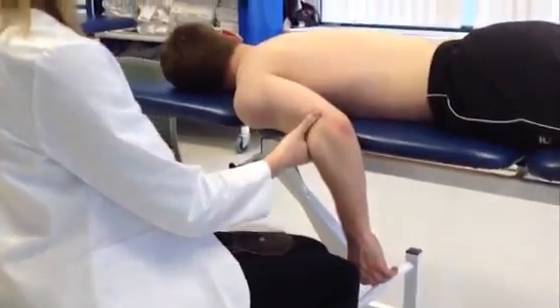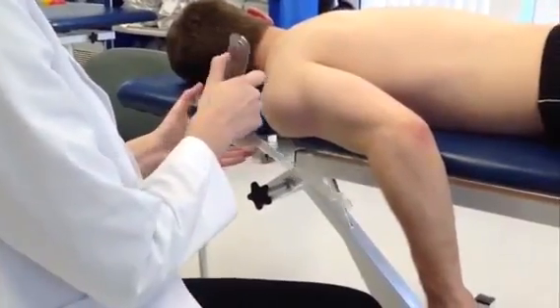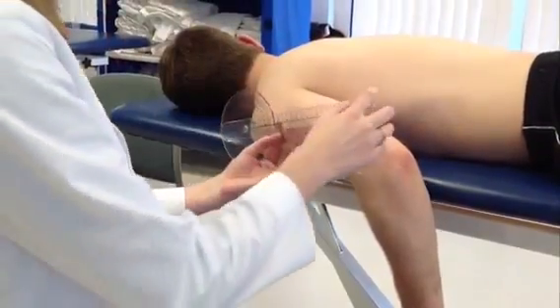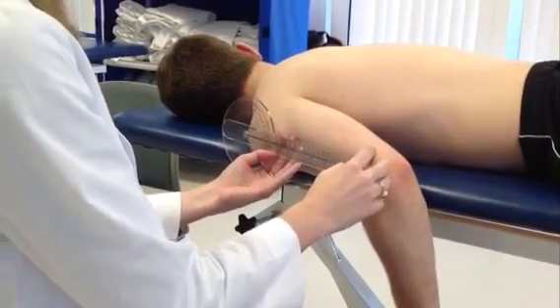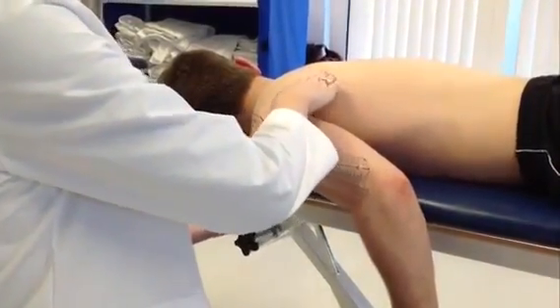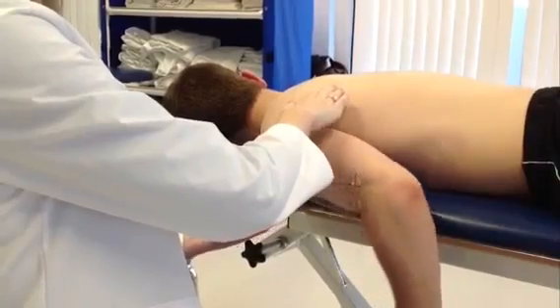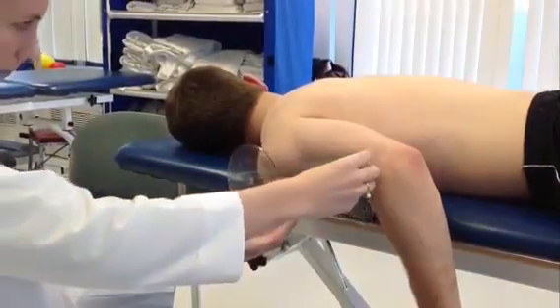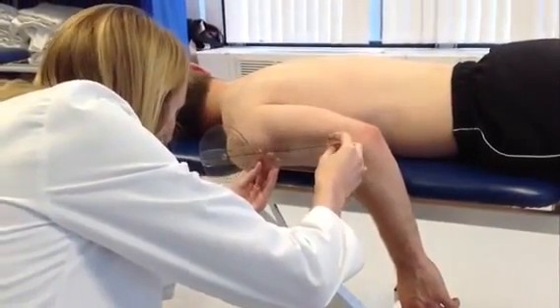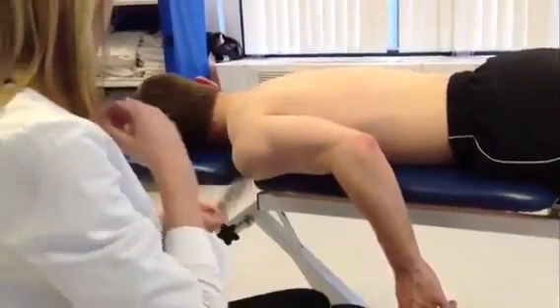So this time I'll have you repeat the motion, and I'm going to be taking the measurement. So same axis at the greater tubercle of the humerus, and stationary arm lined up with the mid-axillary line of the thorax, and my movable arm aligned with the lateral epicondyle of the humerus to get the midline of the humerus. So if you can go ahead and do that motion for me, you can stop, go back down, and I'll just have you do it again. Go ahead, right there. I'm going to take that. Alright, so I get 12 degrees of active glenohumeral extension.